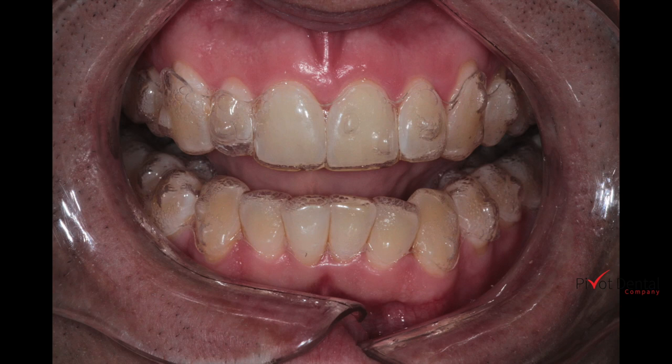Hello, and this presentation is going to be on trying to extrude a lateral incisor with Invisalign, and how working through some checkpoints during a ClinCheck you can maybe catch a problem before it arises.